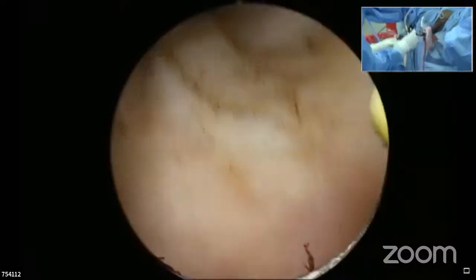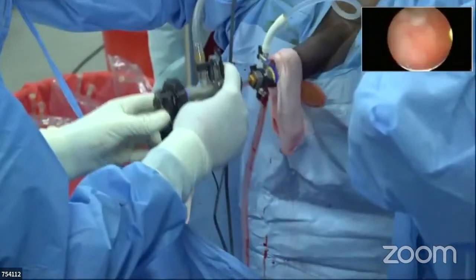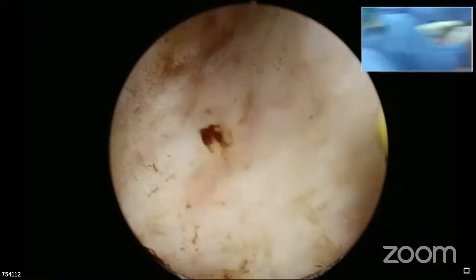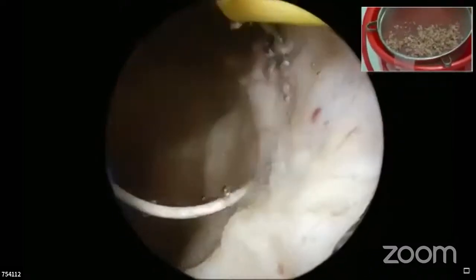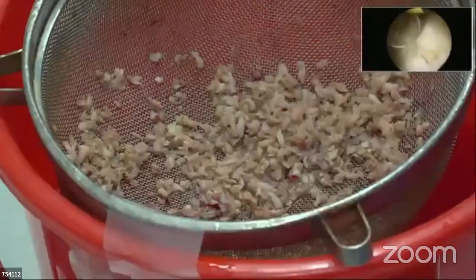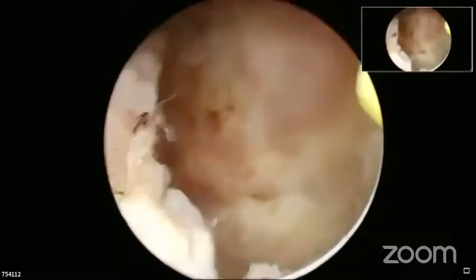External picture. How much is the tissue? Can you show the chips? No, reverse check. So that is the resected focus. Yes, that's right. Excellent, sir. Right, reverse.